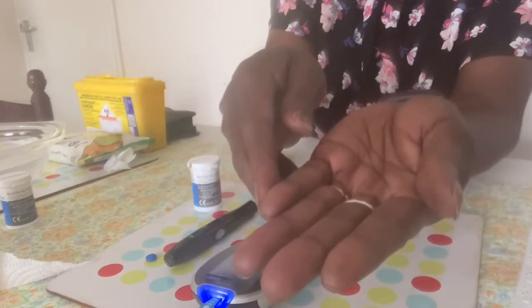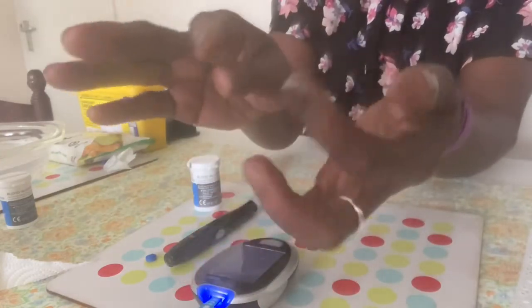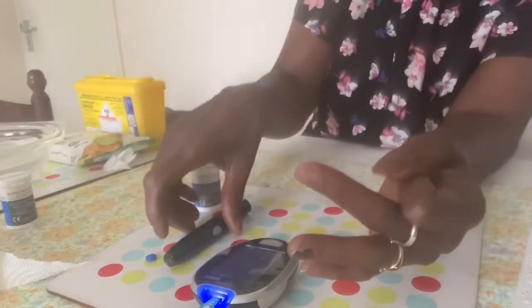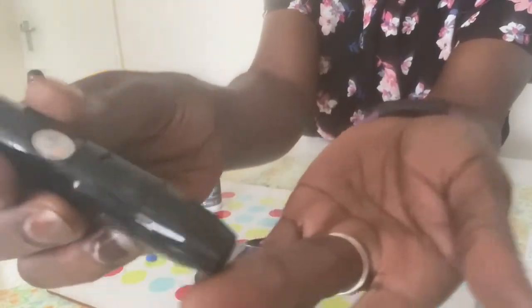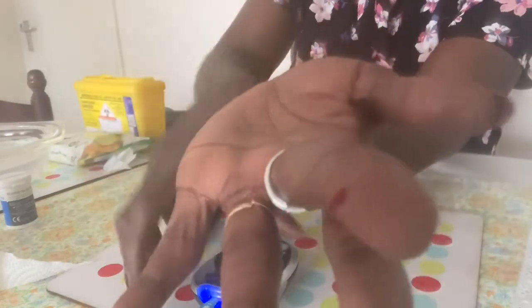Choose which finger to prick, but avoid your thumb or index finger. And don't prick the middle or too close to the nail. Place the device against the side of your finger and press the plunger. Use a different finger each time and a different area.